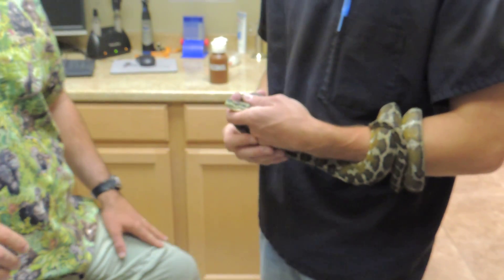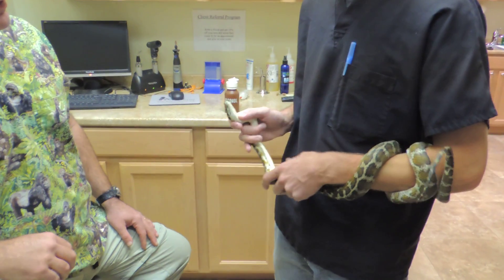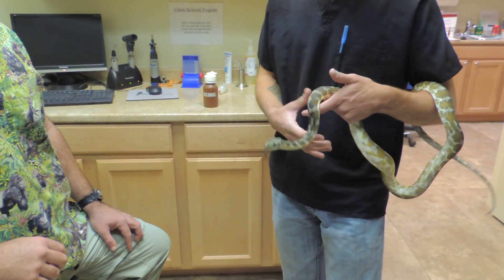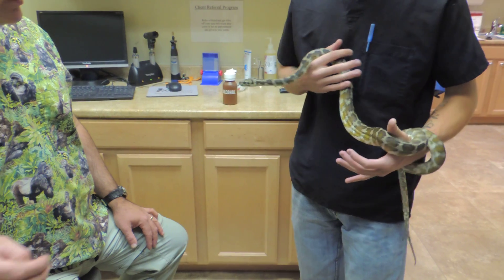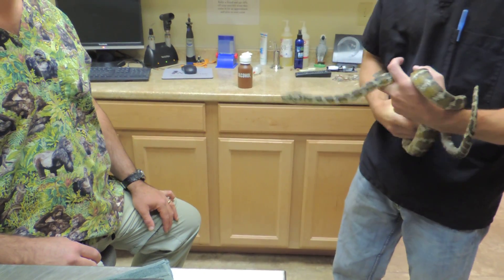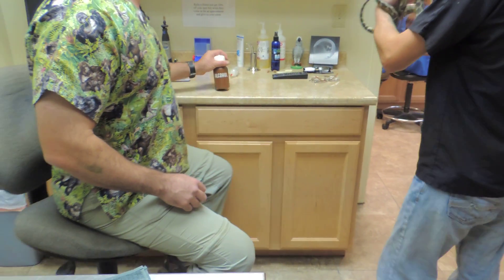With birds we'll use the anesthesia. With snakes they typically don't mind it too much, although he did show some level of "you're pinching me with that needle." It's substantially less with a smaller size needle. But the other snake didn't react at all. Nothing. Anyway, that's that.